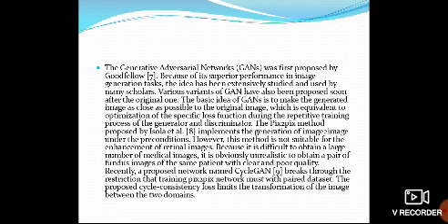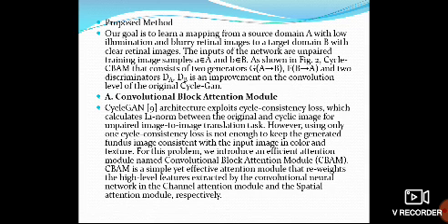However, this method is not suitable for the enhancement of retinal images because it is difficult to obtain a large number of medical images. It is obviously unrealistic to obtain a pair of fundus images of the same patient with clear and poor quality. Proposed method: our goal is to learn a mapping from a source domain A with low illumination and blurry retinal images to the target domain B with clear retinal images. The input of the new network is unpaired training image samples.